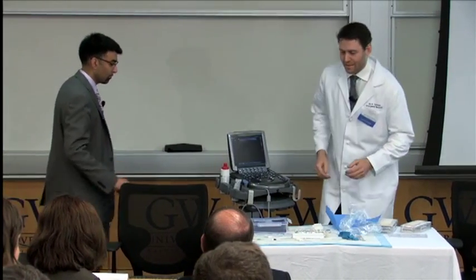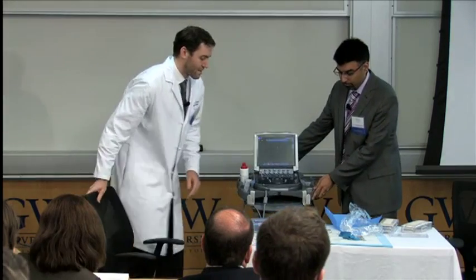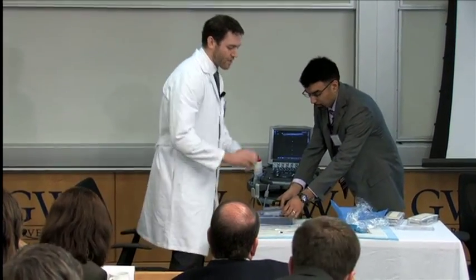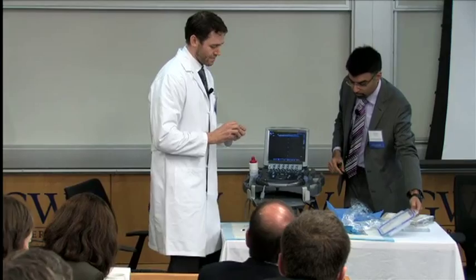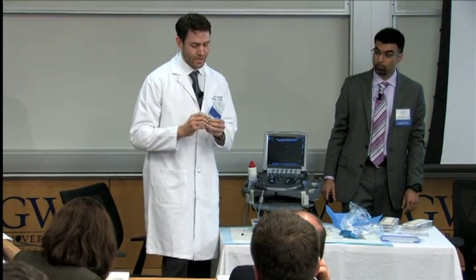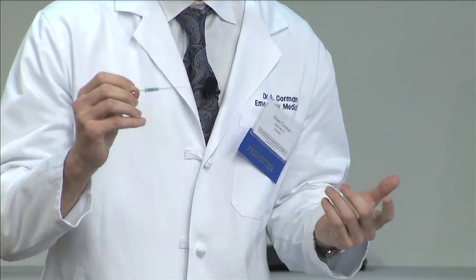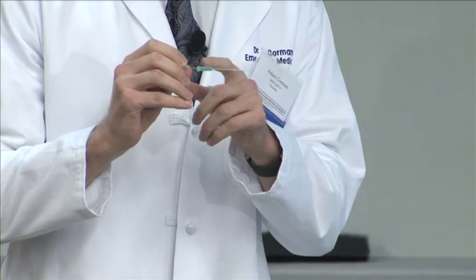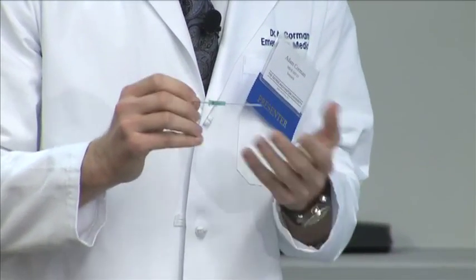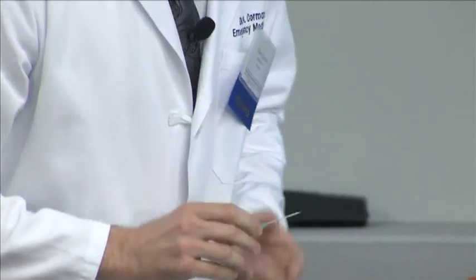And then next we have the catheter introduction set. So here you have two different types of introduction sets. So this is all about introducing the catheter into the skin. So here's the catheter at the end. You can see it's plastic. This cannot be visualized well with ultrasound. And you have a needle that can be visualized with ultrasound, so you follow the needle tip and hope that your catheter goes in the right spot. Afterwards, you don't know. That's traditional.